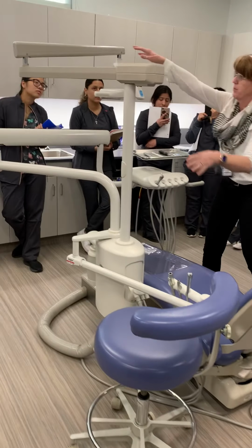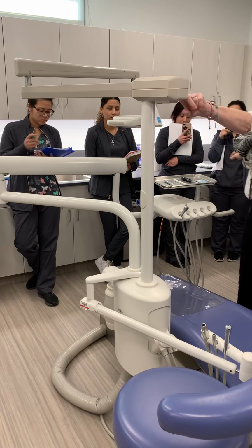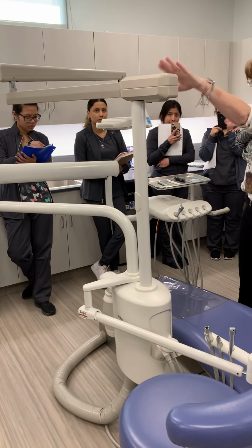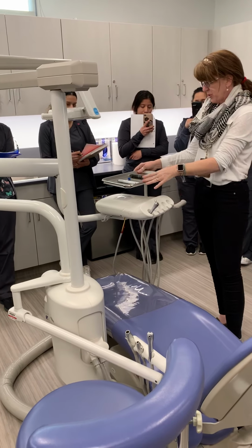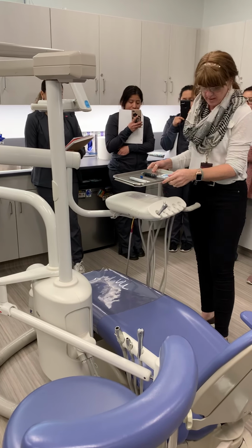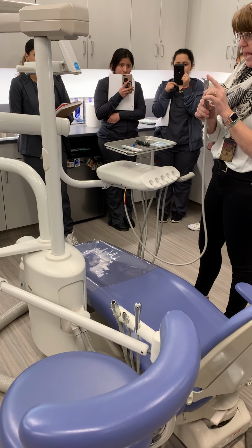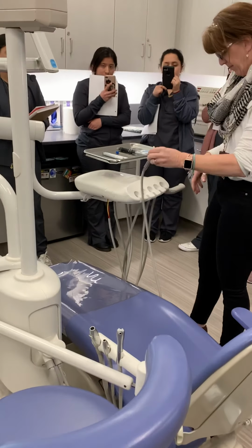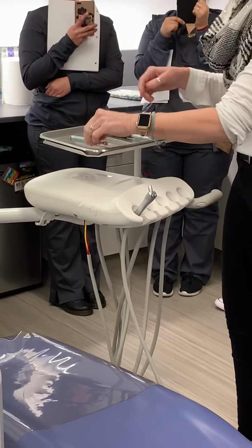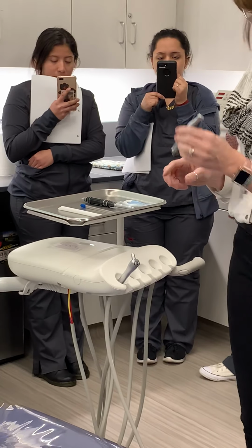So these are the arms, the pole mount, the smelling salts in case your patient faints, okay, spirits of ammonia. We have the bracket tray table for the doctor's instruments. We have the three-way that's air, water, and or both, which you call mist spray. Okay. We have the high-speed contra-angle handpiece, which the burrs are gone.